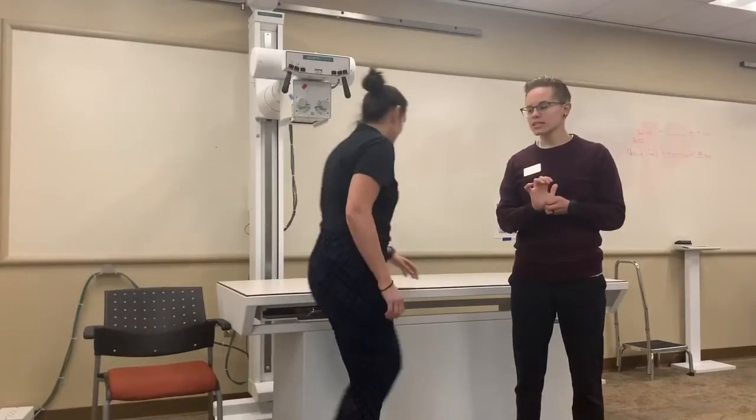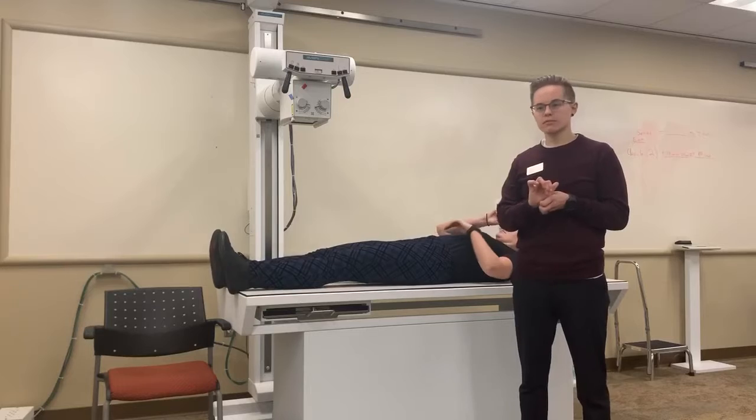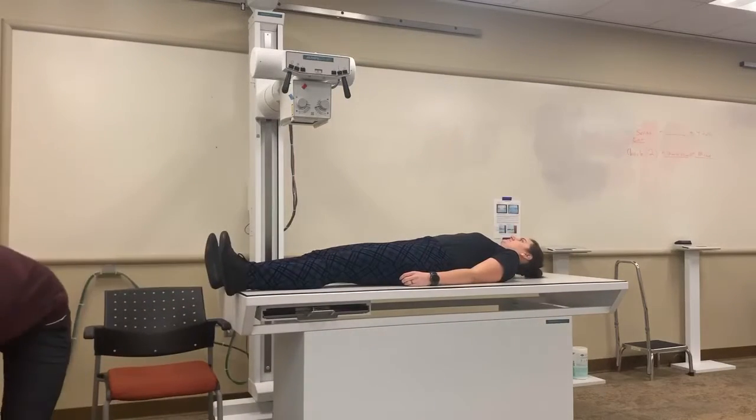So for our standard series in a hip view, we're gonna do an AP pelvis, and then on the affected hip side, we're gonna do a frog leg hip view. That is our standard series.